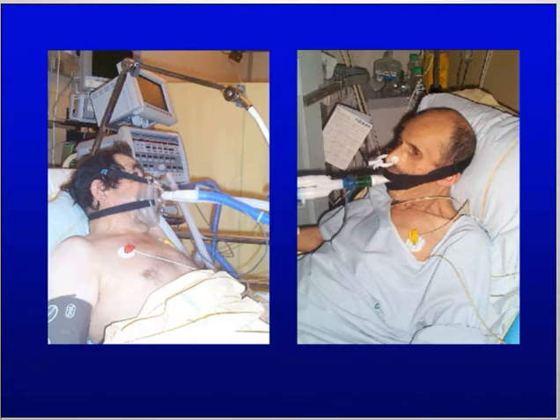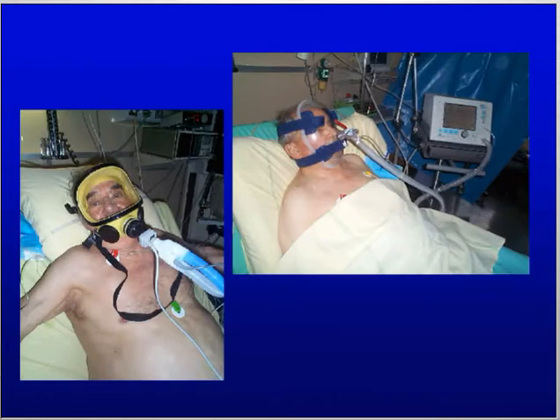In a very few patients, we sometimes use an oral interface, for instance in patients with chronic emphysema, totally mouth breathers, who could do well for a short period of time with this mouthpiece. But we also have a new type of total integral interface, which clearly allows not only to increase tolerance, but also to vary the type of mask and to vary the pressure on the face of the patient.